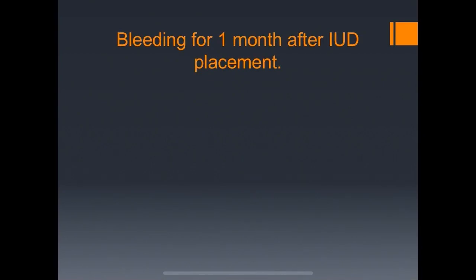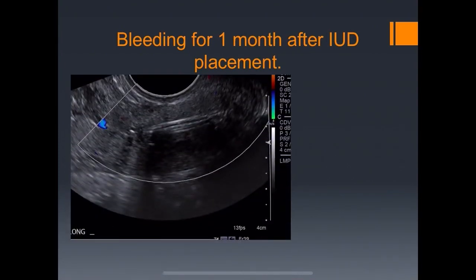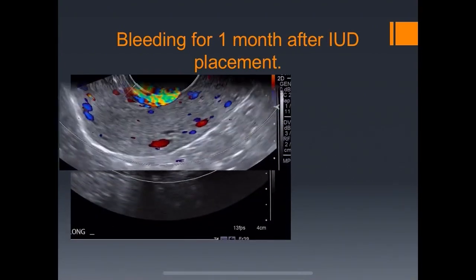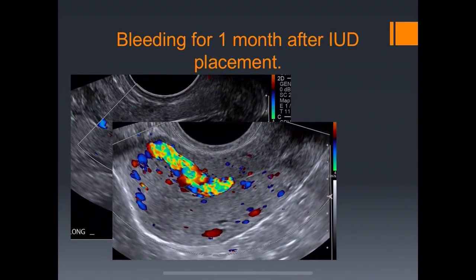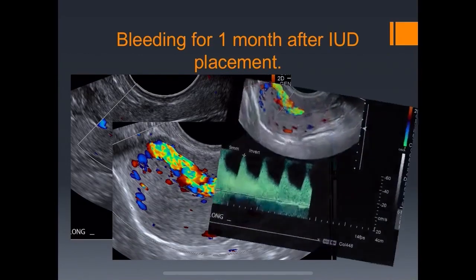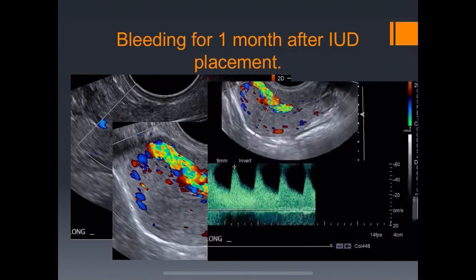A corollary case: bleeding for one month after IUD placement. The IUD is low in position. Color flow shows hypervascular flow extending into the myometrium — another case of an AV fistula or malformation secondary to procedure, demonstrating high-velocity, low-resistance flow.